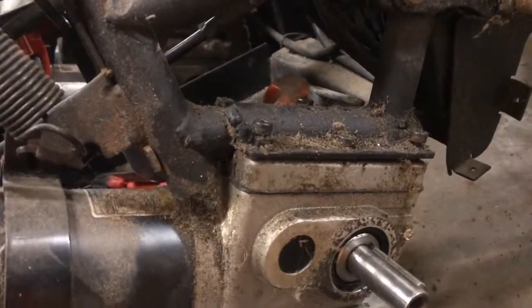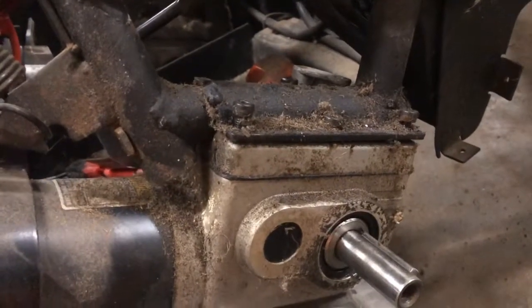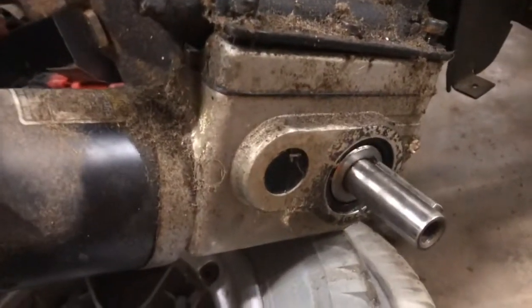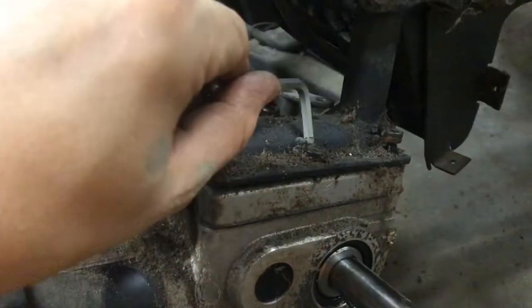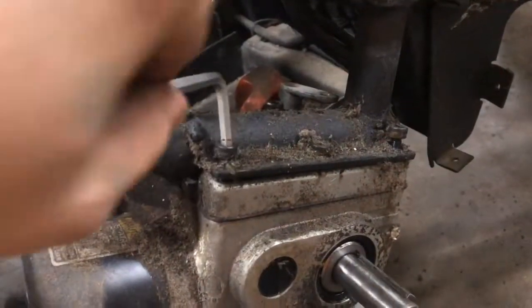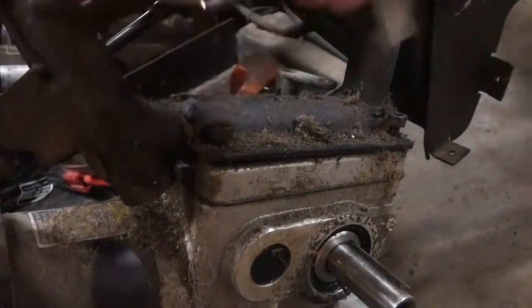So obviously you do need another hand, but you want to make sure the screw comes out straight. That's why I have stuff propped under it. So go ahead and start loosening the rest of them. I'm leaving this one in here. Go ahead and take all of these off. Total of 6 on this plate.